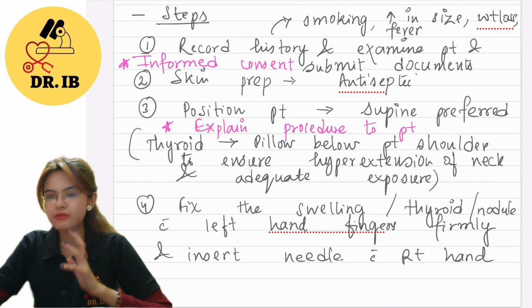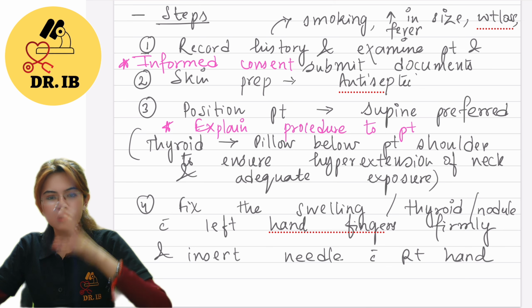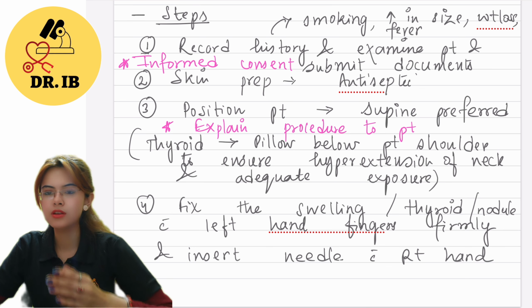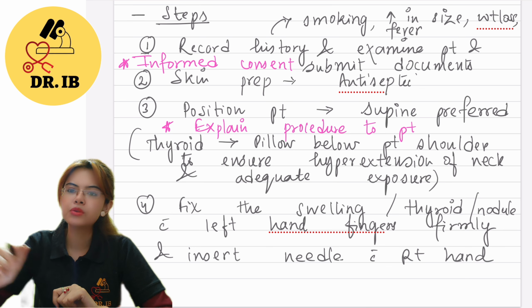Any kind of procedure that we do, you have to fix the lump or whatever, the region, with your fingers. Your left hand is for fixation. And with the right hand, you will do the procedure.